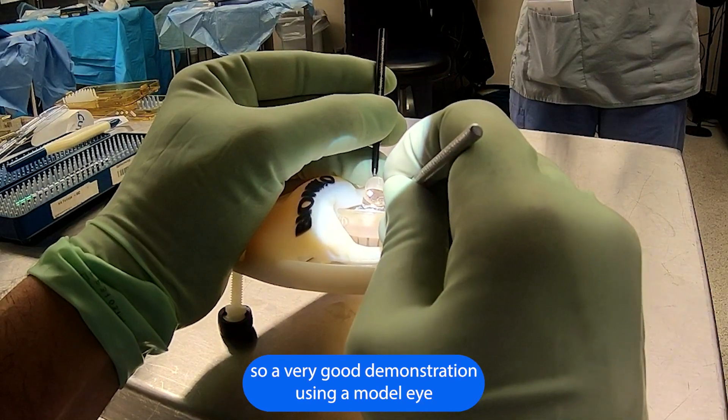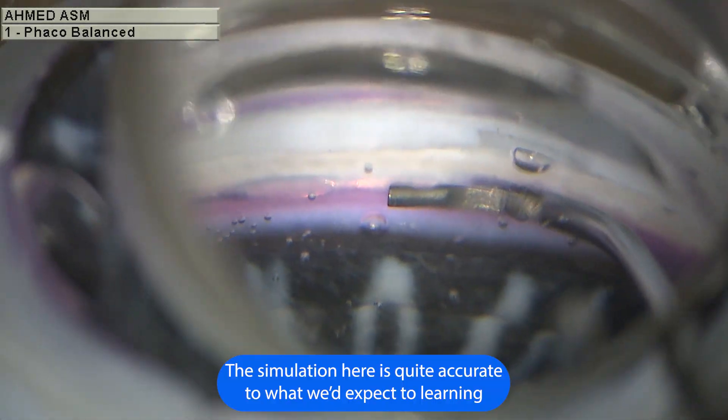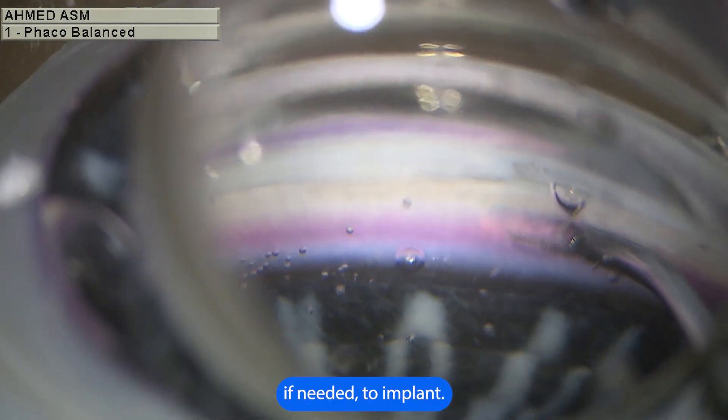So a very good demonstration using a model eye with conventional approaches. The simulation here is quite accurate to what we'd expect when learning the Hydrus Microshunt and all the manipulations needed to implant it.